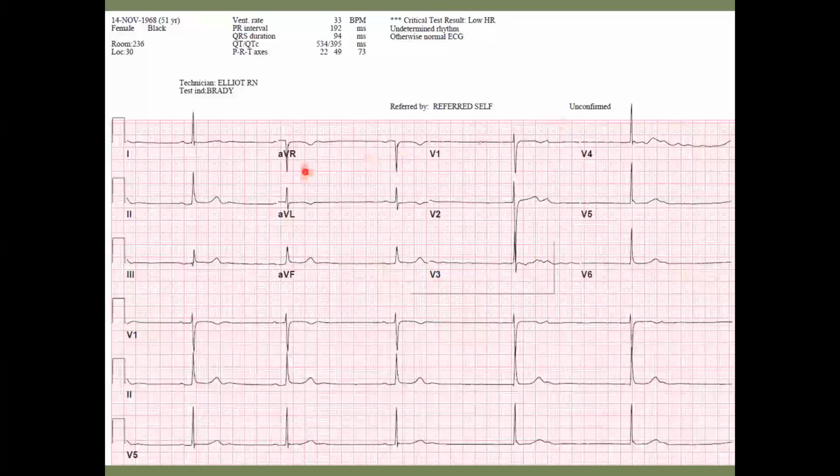You've got your 12 lead up here, and then you've got your rhythm strips down here. When you're looking at these, all of these are being taken at the same time. And that's why you might see something different on this end of the 12 lead than you do at the beginning. Somebody's asking, is this atrial fibrillation? Well, I don't see a lot of fibrillatory waves, but that is a good question. And I do have a nice ECG of AFib that will be coming up.